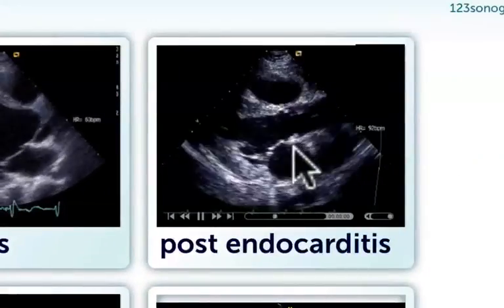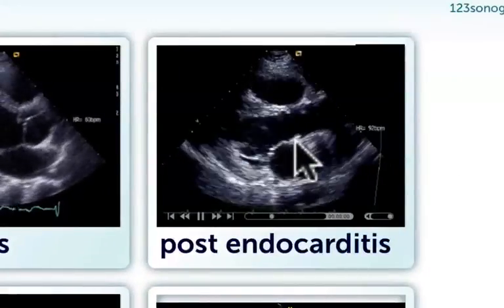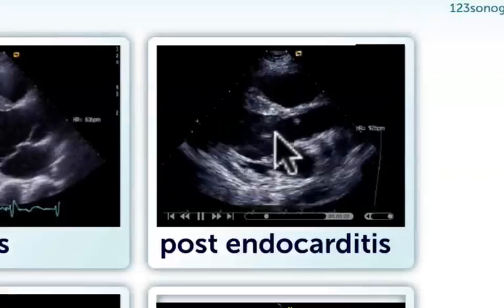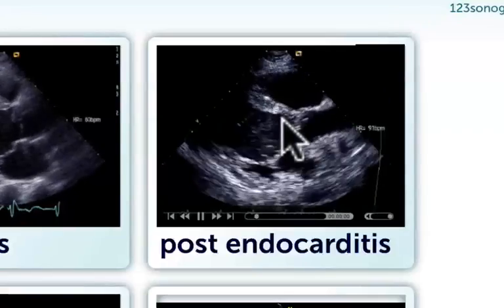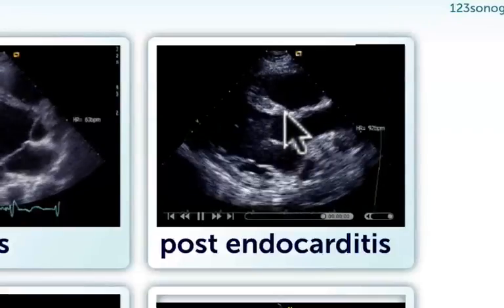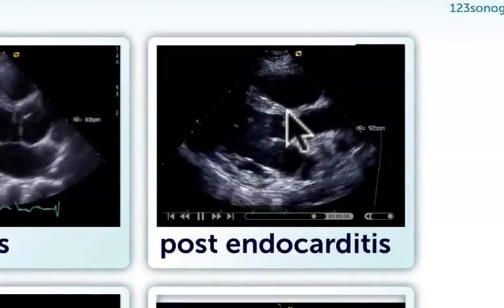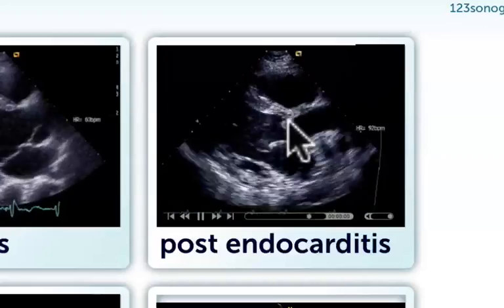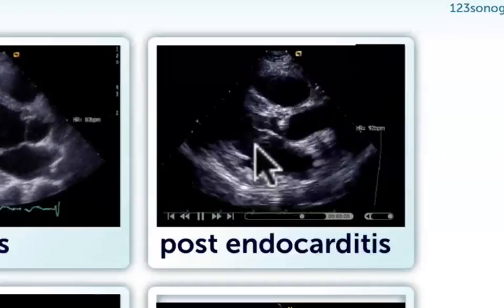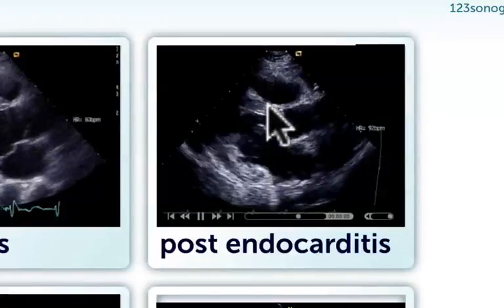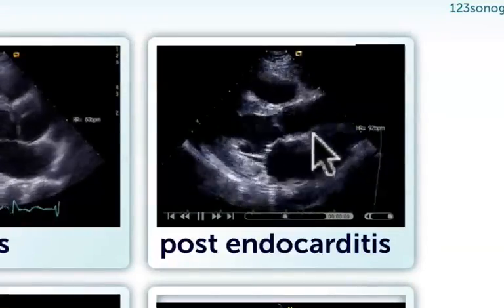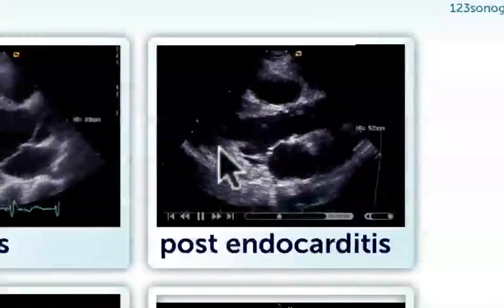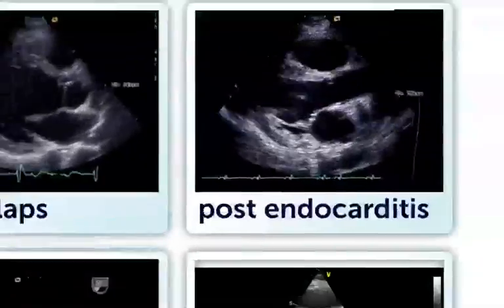This shows you a patient who had endocarditis. You can still note the residual vegetation and thickening of the right coronary cusp. The endocarditis caused destruction of the aortic valve and thereby regurgitation.